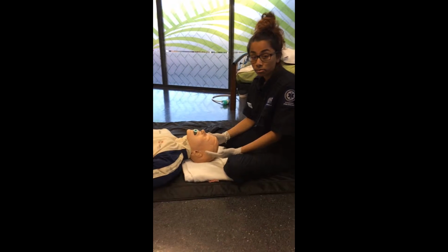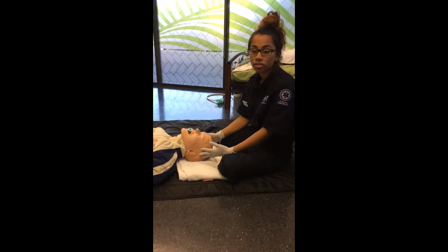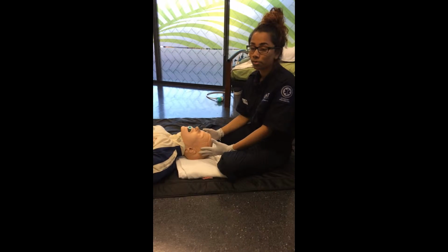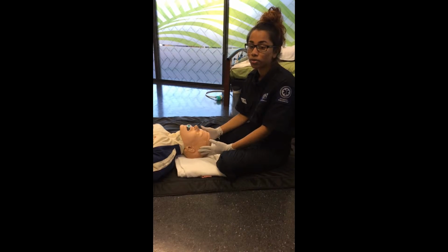Assess if the patient accepts the OPA, and also there are a couple of complications that can arise, such as induced vomiting if the OPA is too large, damage to the oropharynx, or worsened airway obstruction if you push the tongue posteriorly. Reasons for using an OPA are if the patient has a GCS of less than 8 or a score of less than 2 on verbal response.